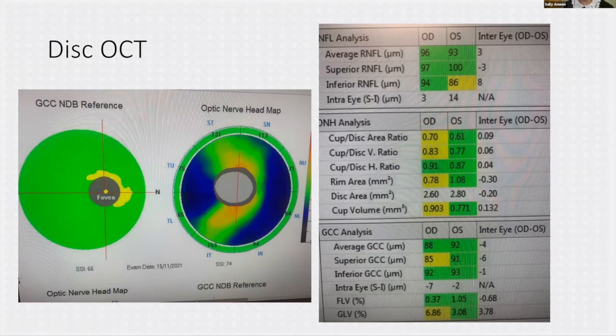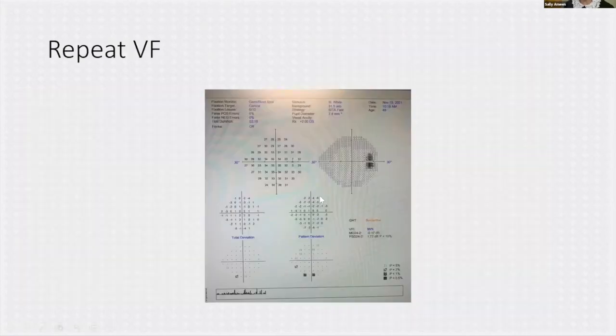So the first thing that we did is we repeated this visual field test. And as you can see, now the false negative has gone down to 0. Pretty much that visual field defect there at the top was gone. And actually what was happening, despite the fact that he was quite young, he did have a little bit of ptosis, and simply just by lifting the lid or asking him to keep his eyes open all the time, he did much better.